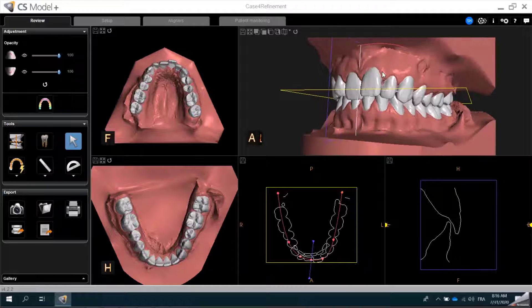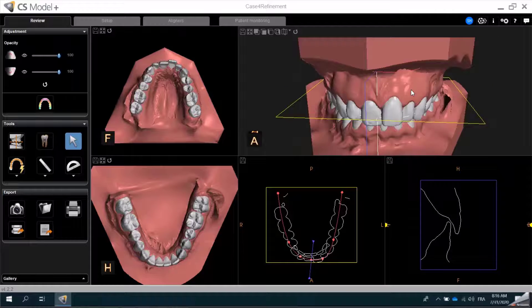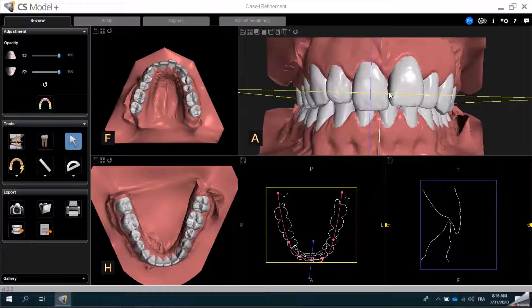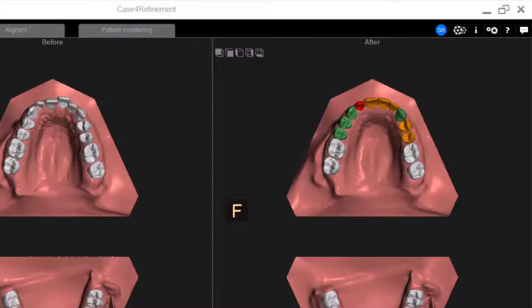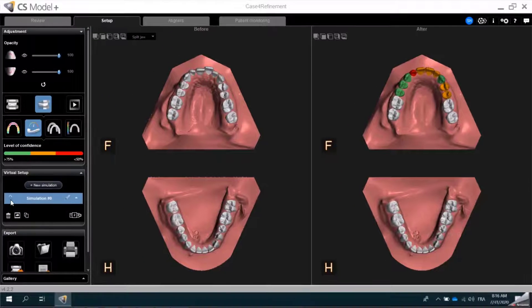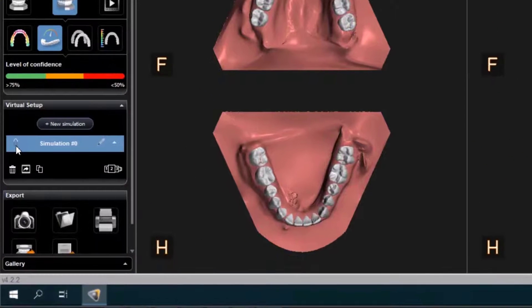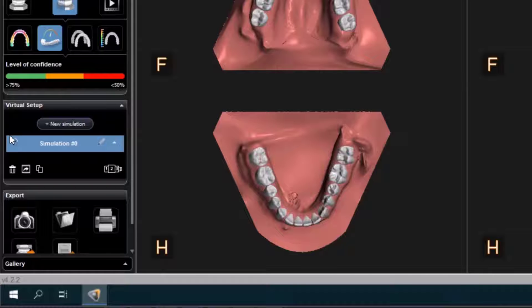In this example, I have already completed the segmentation along with an aligner treatment setup. Since the patient preferred a limited treatment to address upper jaw crowding only, you can see in the setup that only the maxillary arch was affected. In the Virtual Setup panel, notice that only the maxillary arch is highlighted, indicating that it is the only arch being treated in the selected simulation.